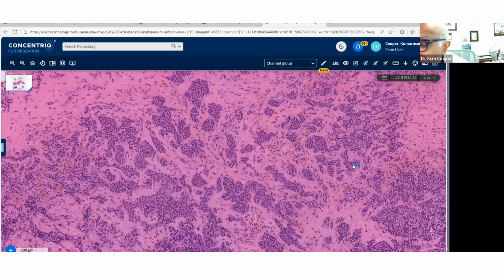Here we go, pseudoendocrine sarcoma, all the way from my good old friend Chris Fletcher. Those are usually paraspinal. They look like neuroendocrine, which this does, nested neuroendocrine. We had 3-4 people say NET, neuroendocrine. So that would be a very, very, very good thought, except it's negative for neuroendocrine markers, negative for epithelial markers. And the only marker that it is positive for is beta-catenin.